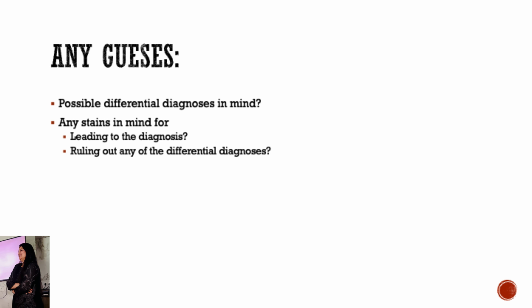Anything from the small round blue cell population you have in mind? Exclude the 2 cell populations. You can go for either single population. S100 was negative. S100 for what?